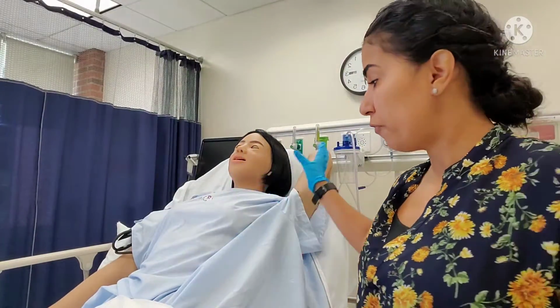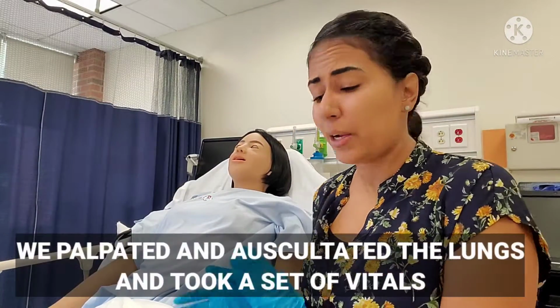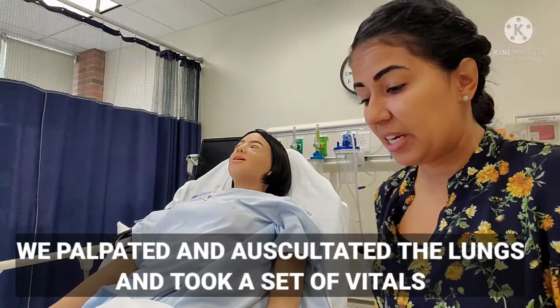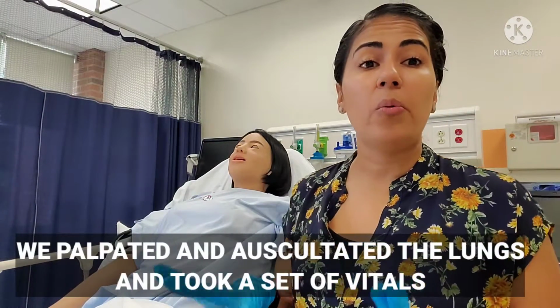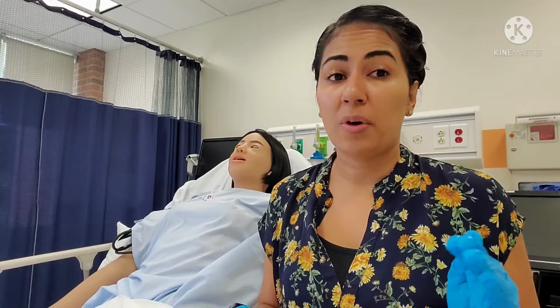Our patient looks comfortable. I'm going to put her arm back. Our dressing is nice and dry and intact. We secured our tubing. We pushed the drainage into the drainage system. Now I want to show you the drainage system and how I would make sure that it's working properly.